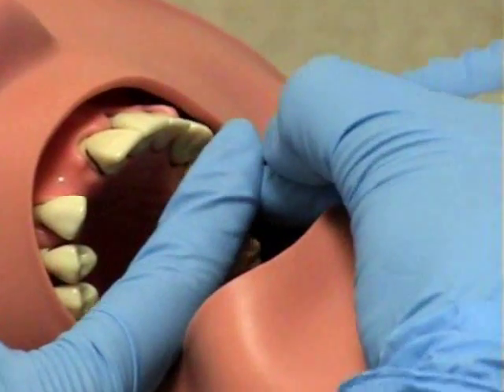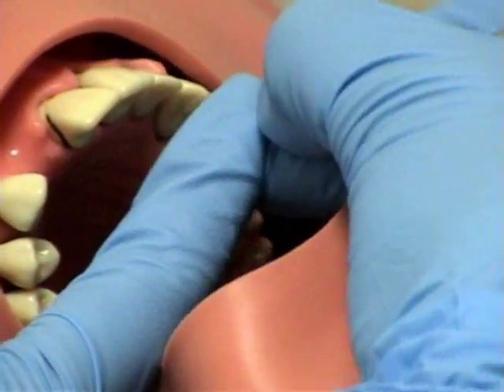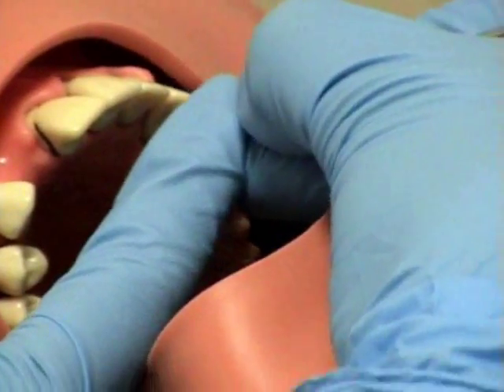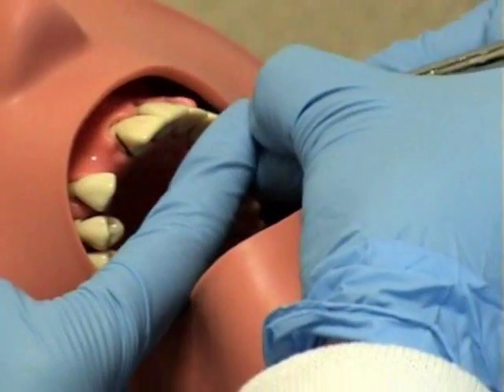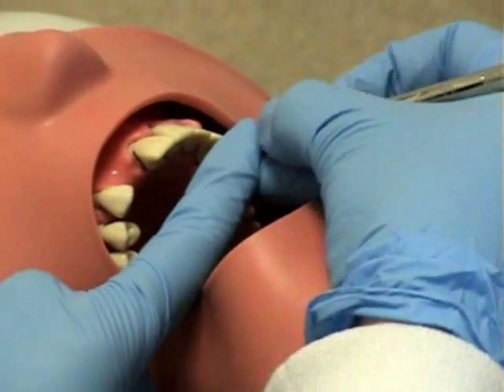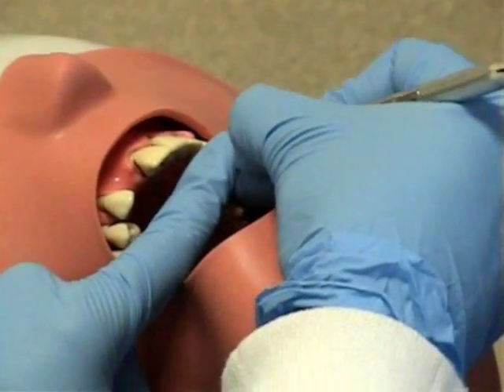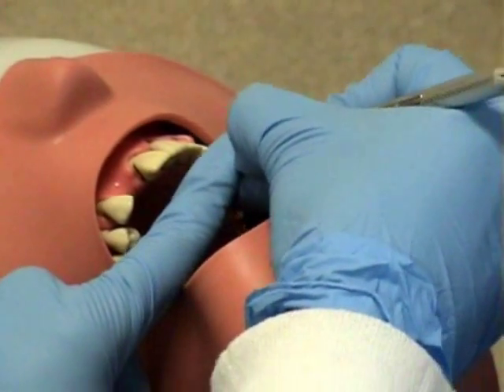Another advanced technique is to use a reinforced hand rest. Here Ms. Johnson is sitting at 8 o'clock working on the lingual aspect of teeth 12 through 16 with an 11-12. With her non-dominant hand applied to the shank of the instrument, she is providing stability to the instrument as well as added pressure.